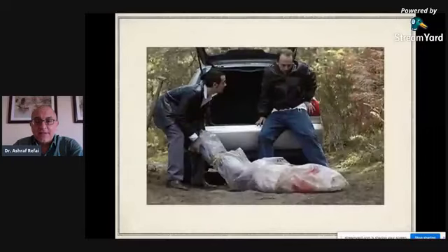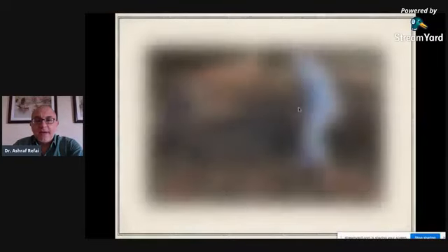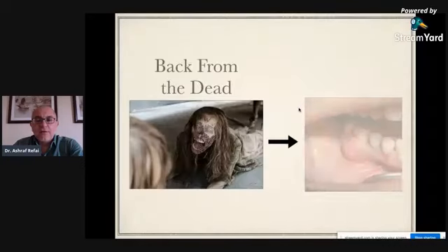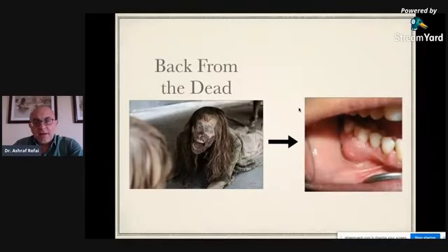Most of the time, most people don't know how to deal with it, and a lot of people deal with it differently. When this happens, they start burying the problem, and then after a while, you get a return from the dead and an abscess or a failure of your root canal treatment. And that happens more often than not, especially with general dentists and general practitioners who don't have the skills or the equipment to decide and to actually try and retrieve these instruments.